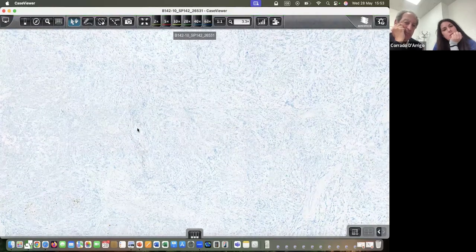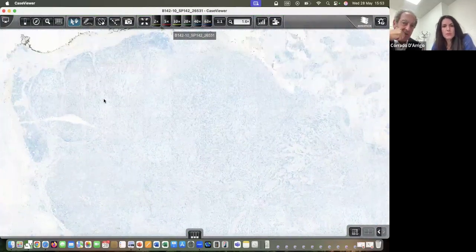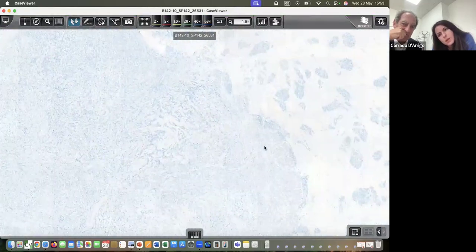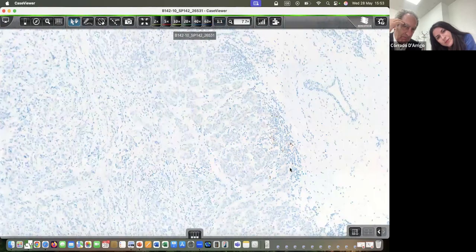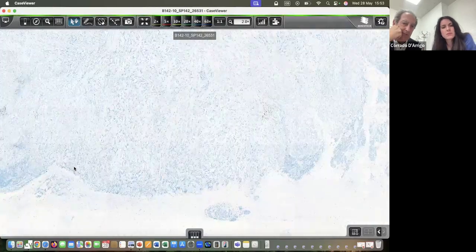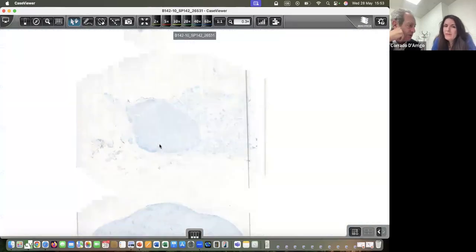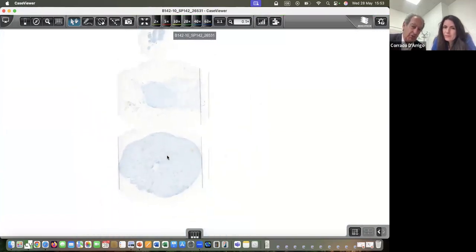Again, I think I would be patiently dividing these areas into manageable chunks and assessing each area, and with a piece of paper, draw a total. I think the primary tumor is negative in my opinion, as a ballpark figure. But it requires a bit more work. The metastasis may be positive, so quite controversial. But what do we do in this case? We could go and look for another piece of tissue, if you so wish, or you can tell the oncologist, this is my findings.